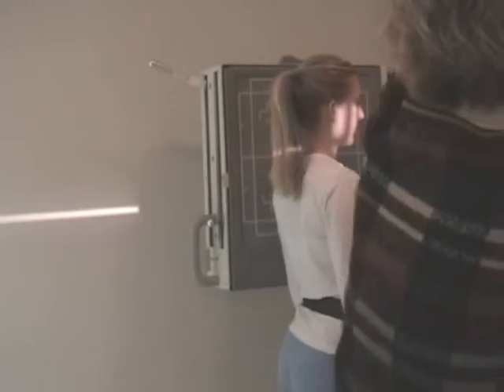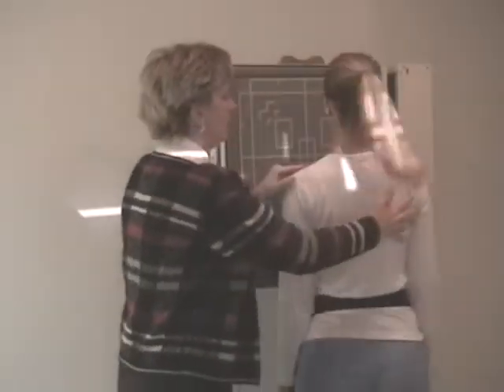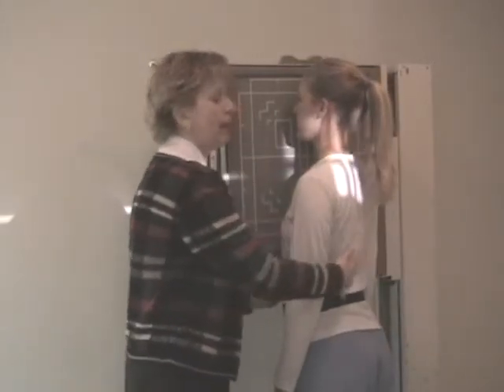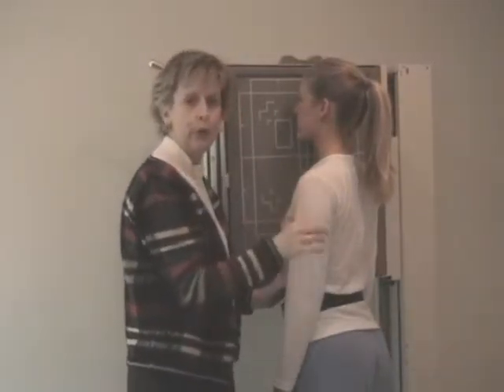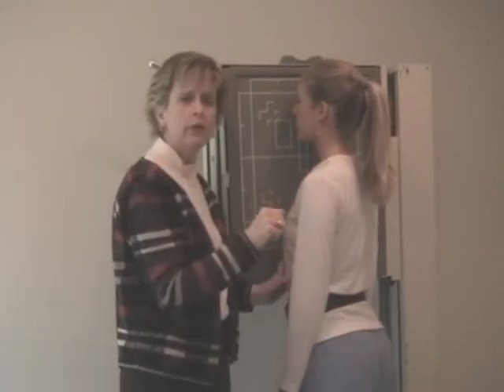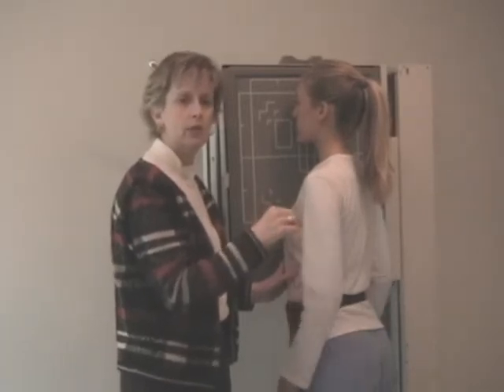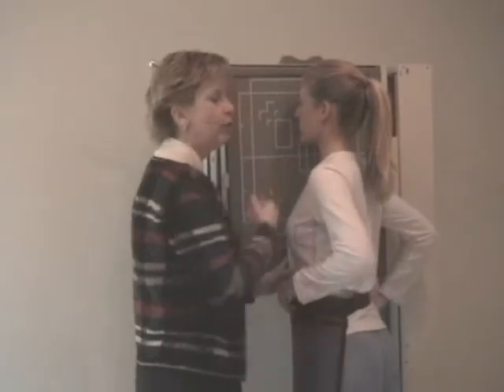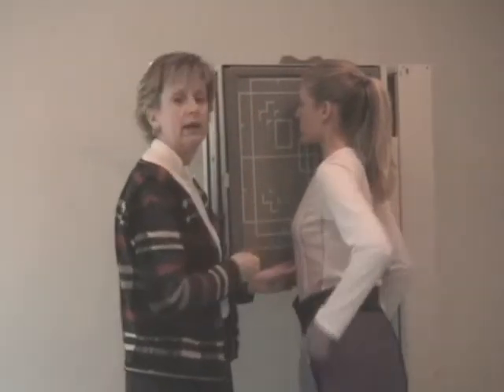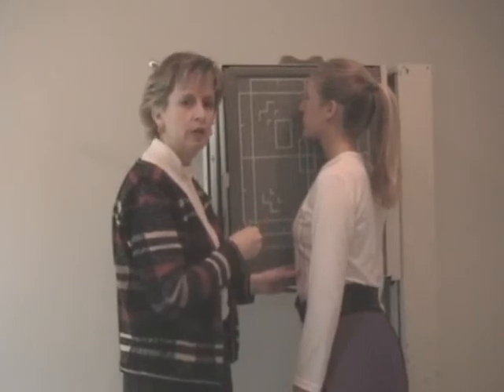Obliques have a 15-degree caudal tube angle. Kristen, let's do a right oblique so they can see you better. You end up doing both obliques, class. You will have to do both obliques because the oblique is to demonstrate the intervertebral foramina. We choose to do RAOs and LAOs. We choose to do the PA obliques with patients in an RAO or an LAO position because we want to demonstrate the intervertebral foramina closest to the film.